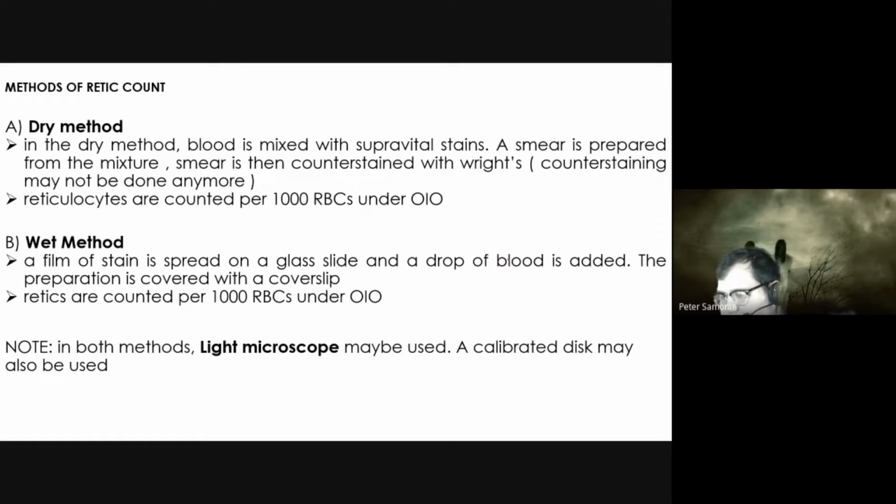Hindi right stain. Romanowski stain yan. Kompletuhin mo. May kulang ka na word. Kompletuhin mo. Kaya mo yan. Okay. So, yun yung new methylene blue.